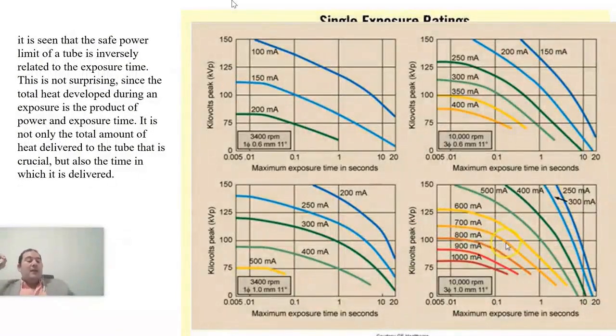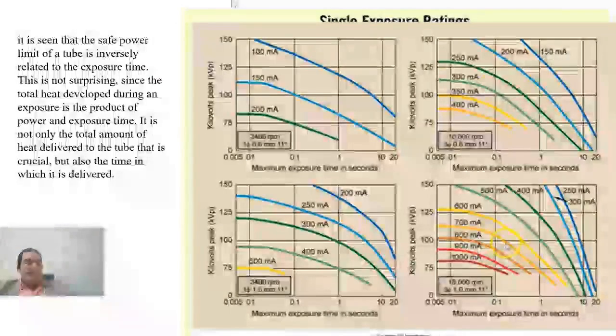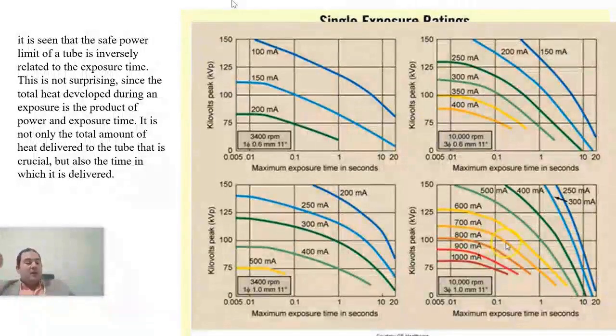One is called Alexion. This machine has a tube of 3.5 MHU, and the tube and table speed are low, so its scan time is long. So what happens is that the technician comes, and while working at the area of the pelvis, he tells the patient to breathe normally. The patient is then stabilized, for example, at the leg area, and the examination continues normally.